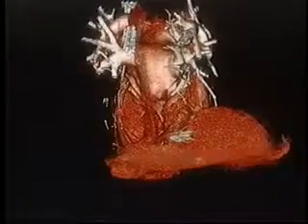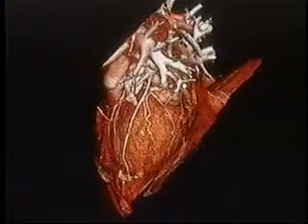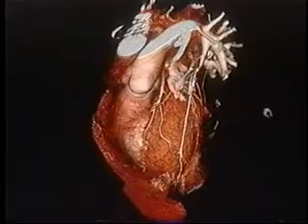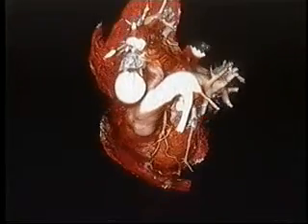The ability to recreate a patient's anatomy is especially helpful when looking for blockages in tiny blood vessels. The two-dimensional world of radiology made locating those blockages a bit more complex for doctor and patient. Before we had to do an arteriogram, which is an invasive procedure with catheters and contrast dye and risk of bleeding or doing damage. With this, all we do is start an IV, inject the contrast, acquire the data, and then the real beauty of this is all this is done after the fact.